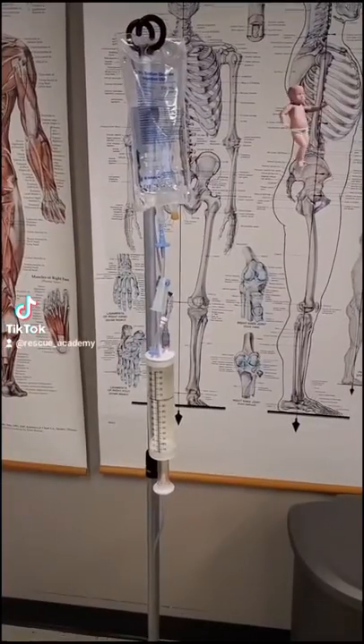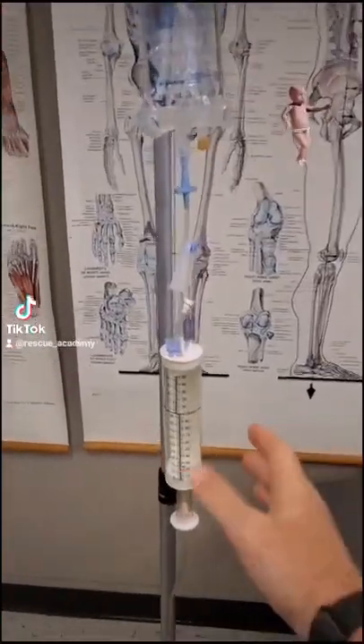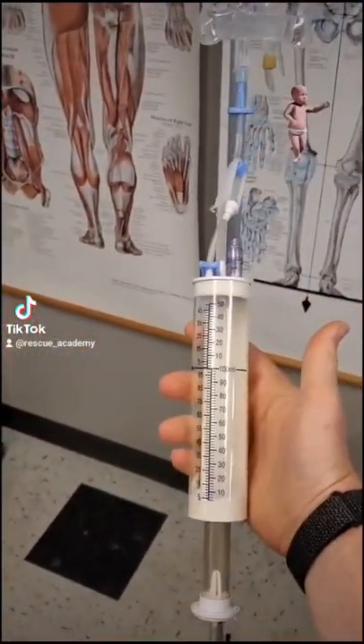Hey, are you ever curious how we give fluids to little kids? We hook up a Buretrol set. Let me show you how this thing works.